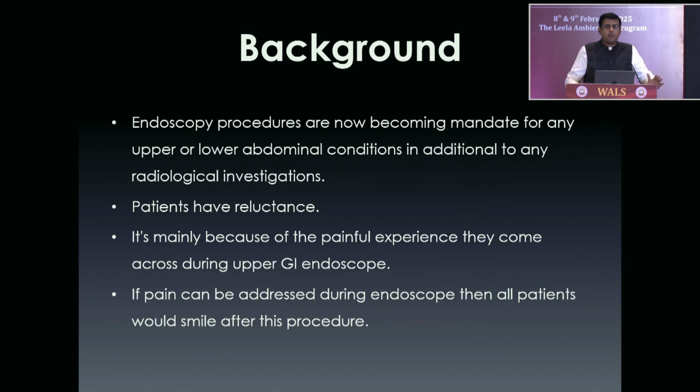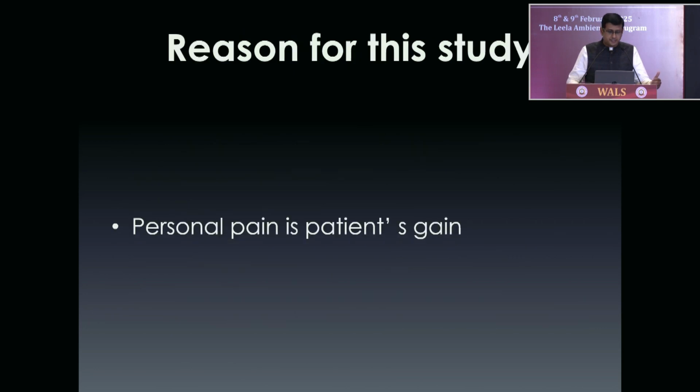The background is that endoscopy is mandatory for almost all GI complaints, whether upper GI or lower GI. But the problem is patients do not accept this procedure because they have a dreadful experience with the pain. Their relatives or somebody has told them not to undergo this procedure because it's very painful, you have a sore throat, you cannot speak for 2-3 days, and all those things sway patients away from you. You also have no choice but not to force the patients when they don't subject themselves to conscious sedation.